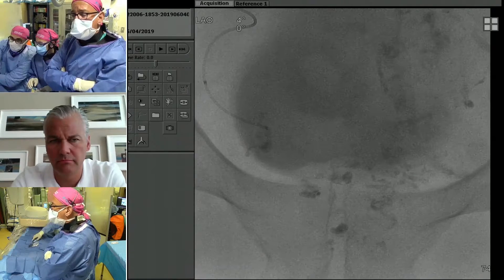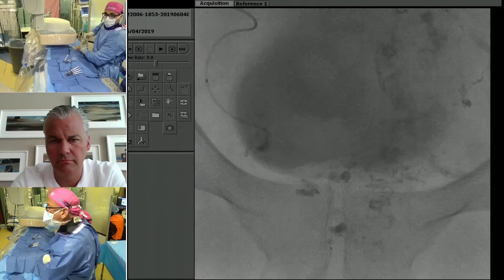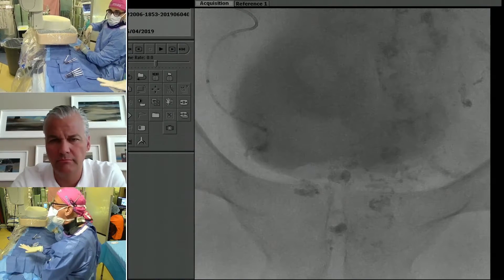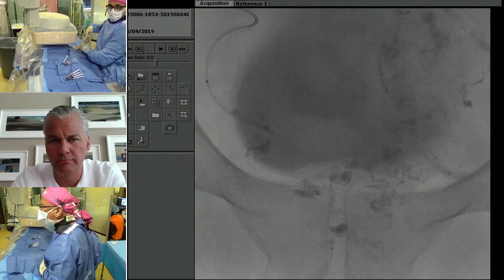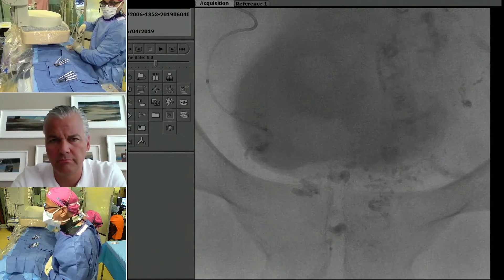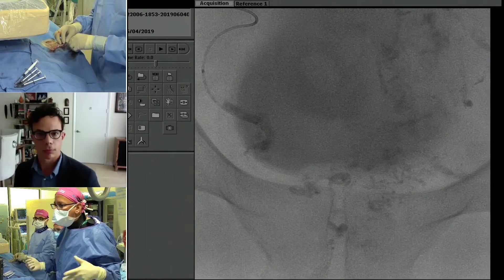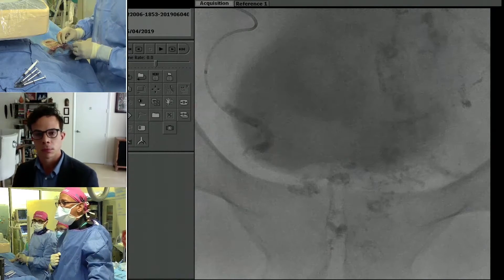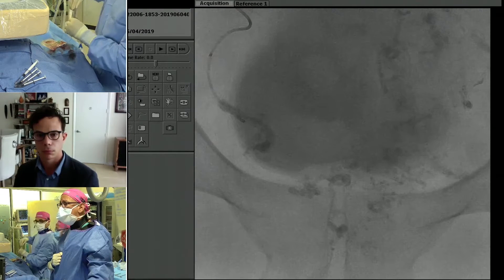We're getting a little bit of reflux. I think that was actually a very good concentration to penetrate the nidus. Now we're getting a little bit of reflux, so we're just going to wait about 30 seconds before we remove this microcatheter. Now it's a good time to remove it — as you can tell, we waited a really long time, about two minutes.